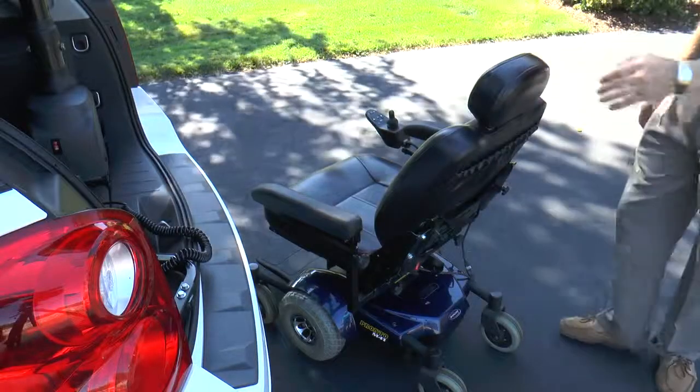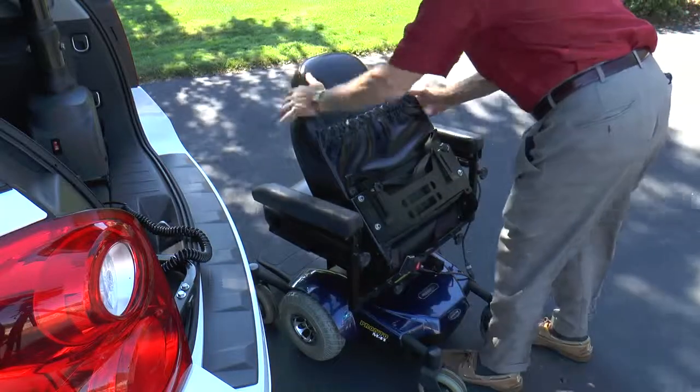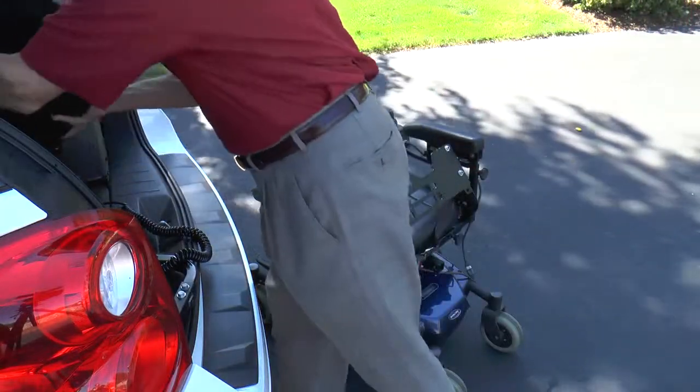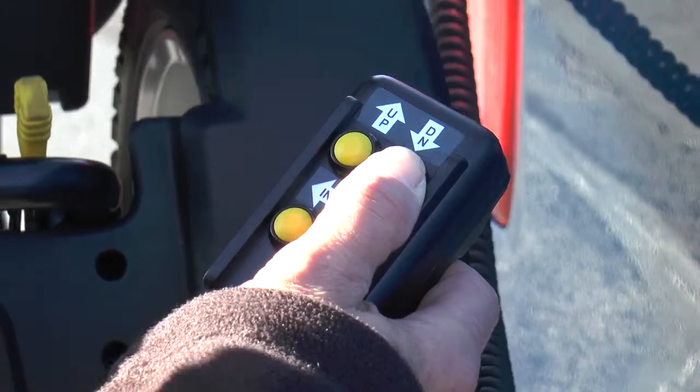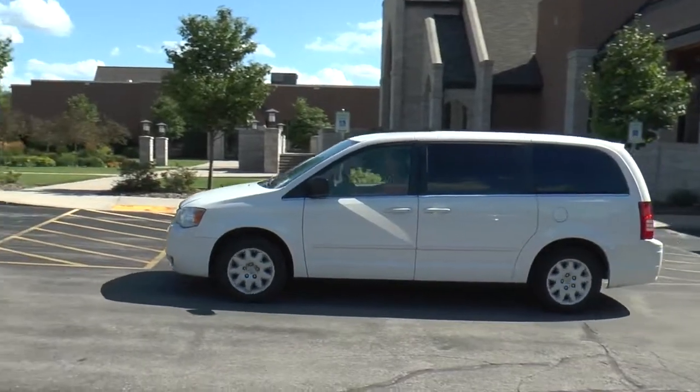Bruno's unique back-off device easily removes the back of select scooters or power chairs to make loading the mobility device into smaller openings possible. And the Curbsider's optional weather-resistant hand control is ideal for owners of pickup trucks. Count on Bruno's Curbsider to give you the freedom to hit the road.